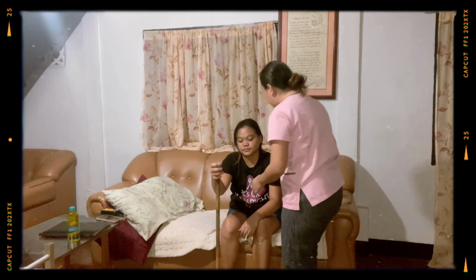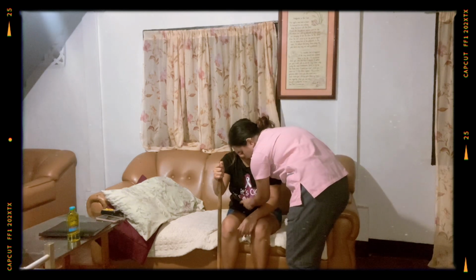So for procedure number 7, have the patient hold the cane on his or her stronger side, close to the body, while the nurse stands to the side and slightly behind the patient. So this is to provide maximum support and appropriate body alignment. So, ma'am, I will help you stand, okay? So 1, 2, 3, go.